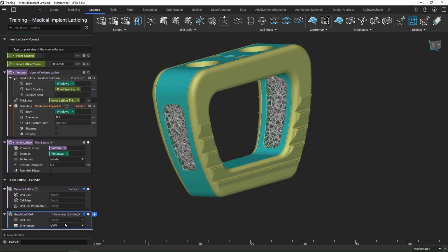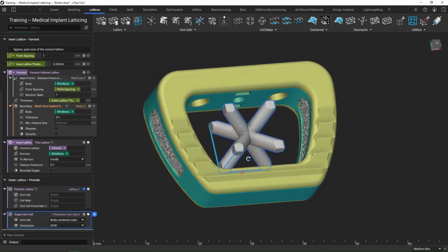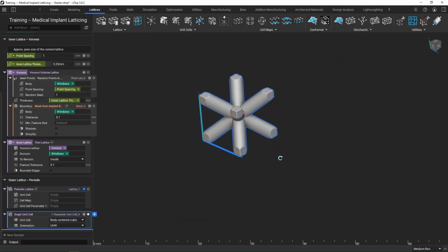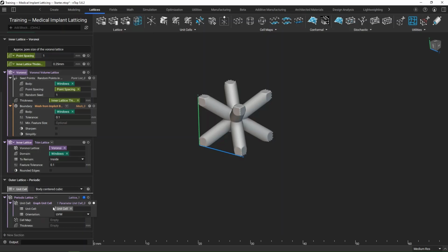So I can click on this unit cell. We have plenty of different unit cells all built into nTop that we can play around with. I'm just going to go with a body-centered cubic for now. As you can see, it pops up right in the middle of our implant. Actually, a cute little frame that we have around there, but that's just going to be a preview of the lattice that we're working with, that unit cell. So I can go ahead, bring that into that unit cell input. I'm also going to right click and make this a variable too, because maybe this is something that we'll want to play around with when we're iterating with our custom block in the future.